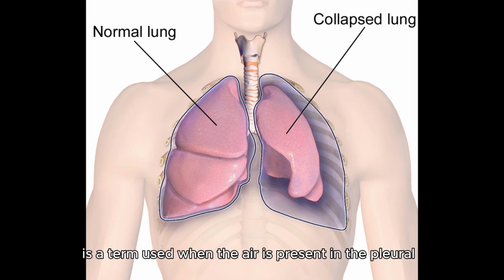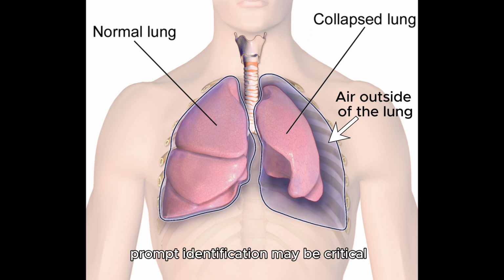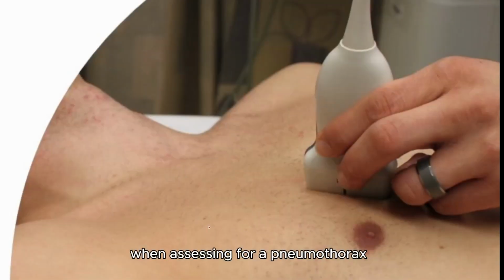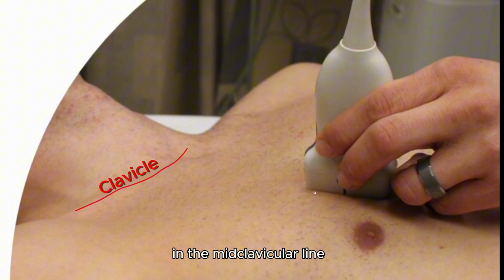Pneumothorax is a term used when air is present in the pleural space, which often causes collapse of the adjacent lung. Prompt identification may be critical, and bedside ultrasound may be particularly useful as it's both quick and highly sensitive.